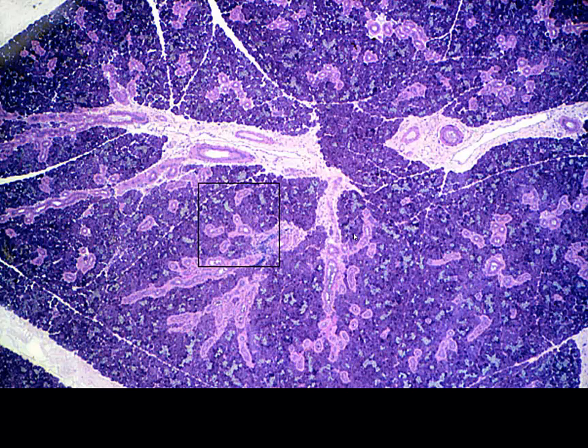So as we look at the field of parenchyma, the first thing we're struck with is the number of ducts that we see in cross section. We can also see the dark blue to purple parenchyma, the serous, but then we see the lighter, almost aqua color. Those are going to be the mucus acini. And just in this global view, looking at the percent of purple to this aqua color, you can see about 90 to 10. Certainly overwhelming, we're going to have the serous.